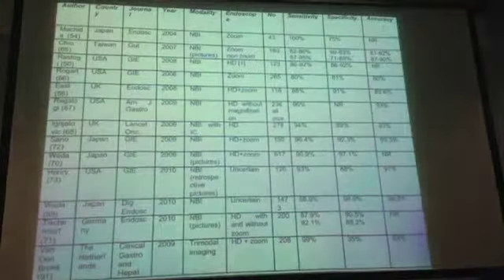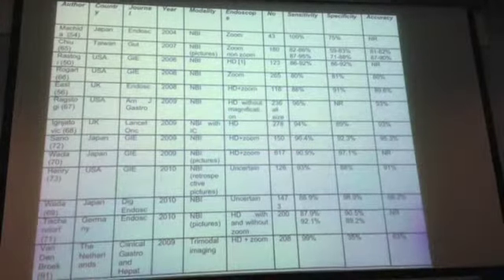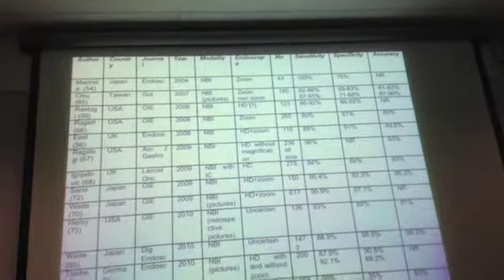These results have been echoed in many other studies into narrowband imaging. You see there's a lot of literature out there for it now, both with zoom endoscopes and without zoom endoscopes, importantly, which would suggest that NBI is a very effective technique.